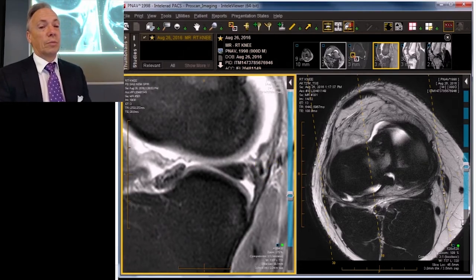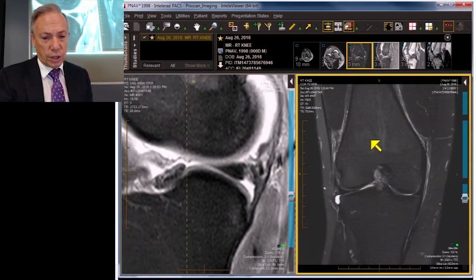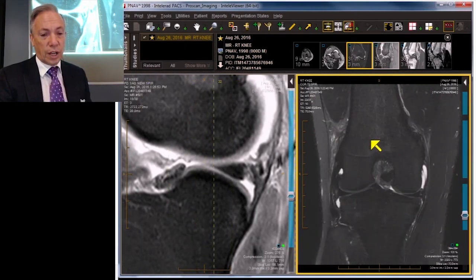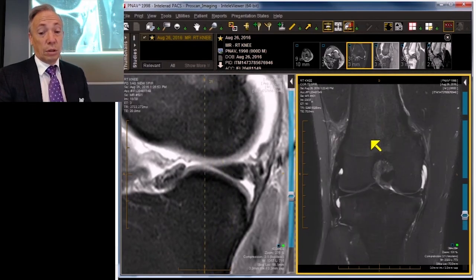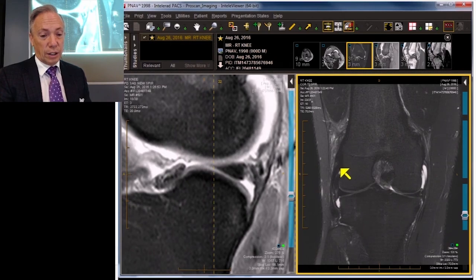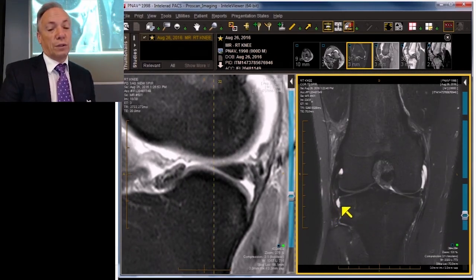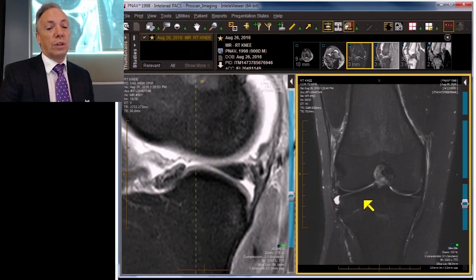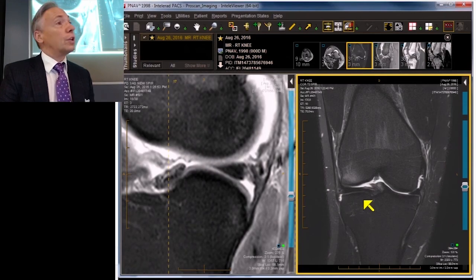Let's just take a look at the coronal for a moment, because this is such a nasty injury — just out of curiosity. The collaterals are not too bad looking. There's the tibial collateral ligament and here is the fibular collateral ligament. So there hasn't been a major varus or valgus force, or a major twist associated with this injury. Okay, let's do another one.